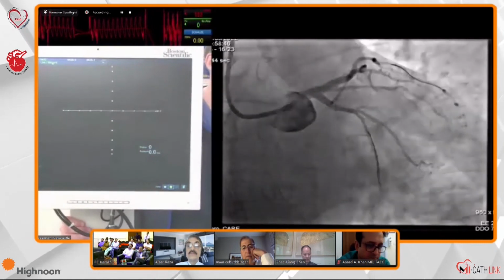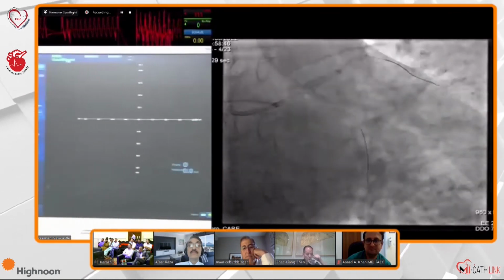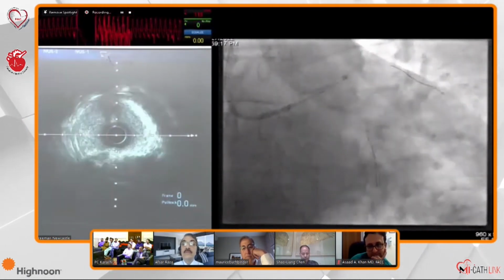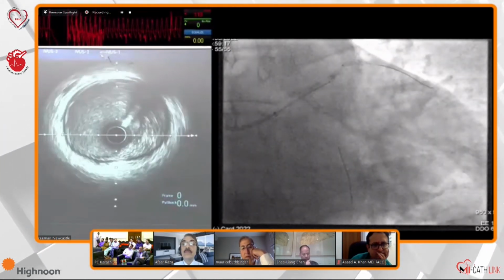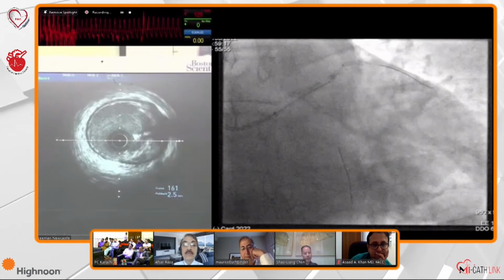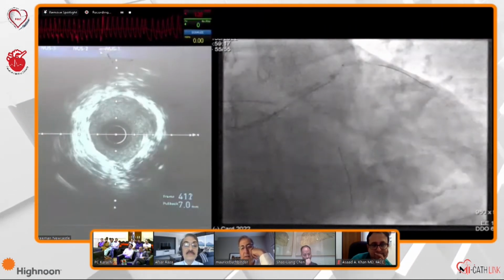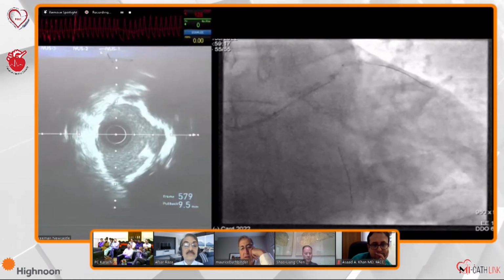Okay. Beautiful. Thank you. It's going to come in. Look at this. A huge left main. This is the LAD. Yes, we're starting from there. You see how it looks? Almost 5, and everything is close to 5. So we're going to come to the area of heavy calcification, but the cross-sectional area here is going to be huge. Very well expanded, very well deployed and apposed.